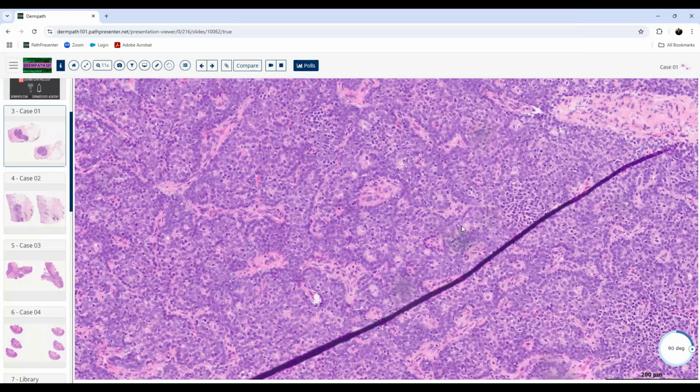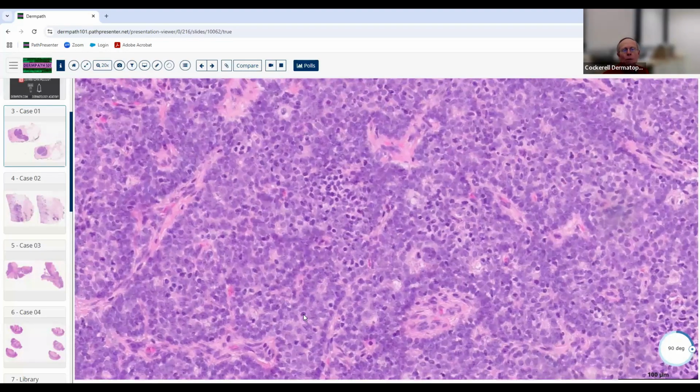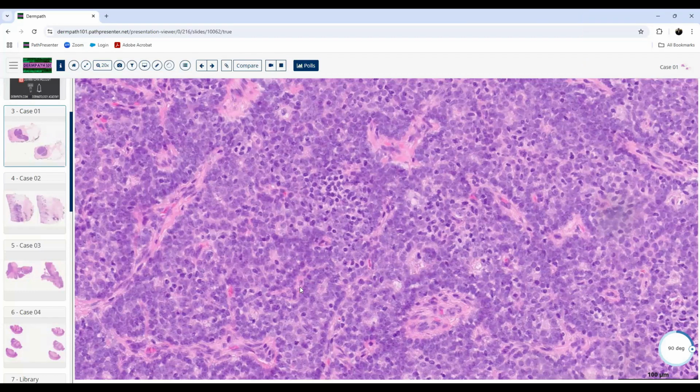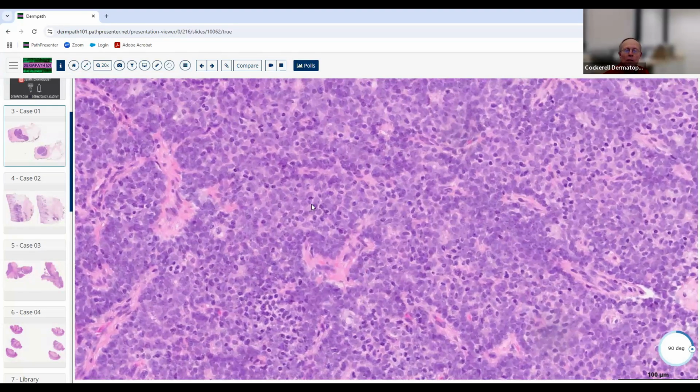It would. Now, what's wrong with it for spiroadenoma, though? What's not so great about it? It's missing a couple of things, isn't it? What do you usually see within the sea of blue cells in a spiroadenoma?